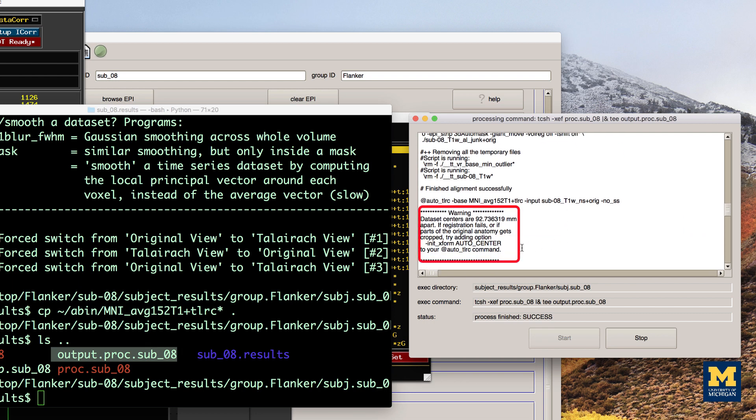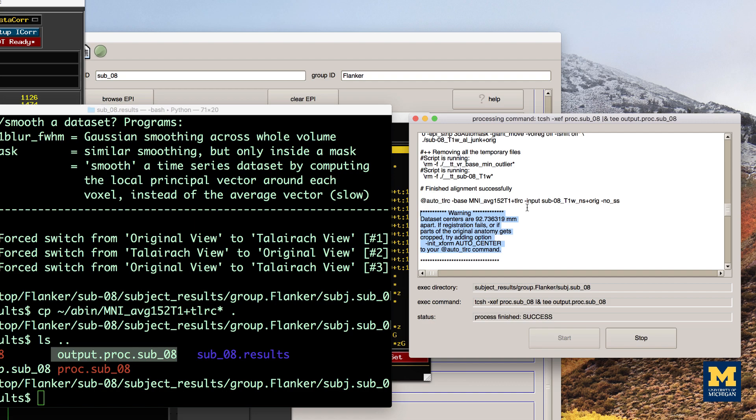Apparently, the centers of the anatomical and template images are very far apart. The output says that if parts of the original anatomy get cropped, which is our current problem, try adding the option -init_xform AUTO_CENTER to your auto_tlrc command.